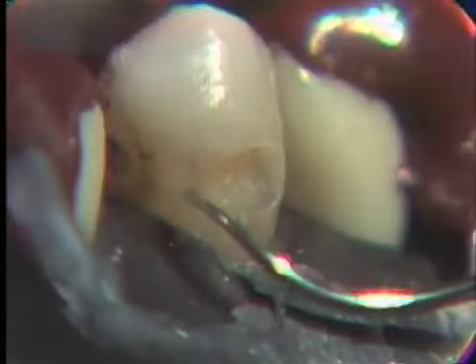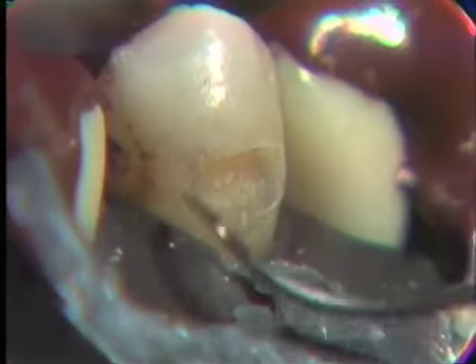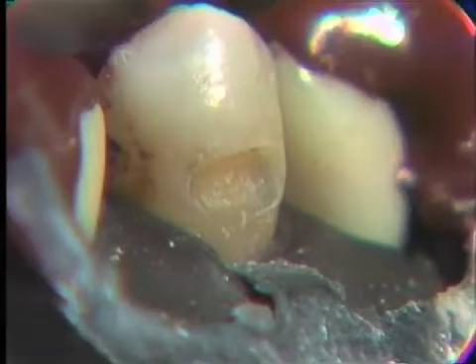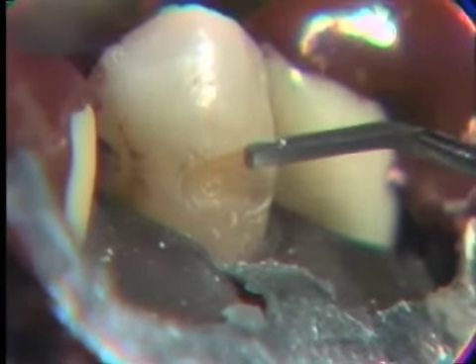Now we'll check again with our number 3 cow horn explorer, checking the continuity of this enamel, feeling the walls. Now it appears that we have removed any of the chipped or overhanging enamel, that we've eliminated the pitting effect over on the distal surface, that we have a sound enamel wall around our cavity preparation. Now, to ensure that we have this, we may select a 10/6/8 cutting instrument along our occlusal wall to plane in this direction.